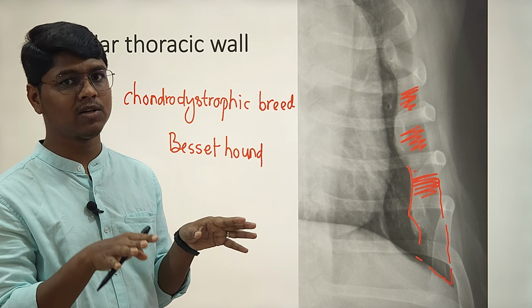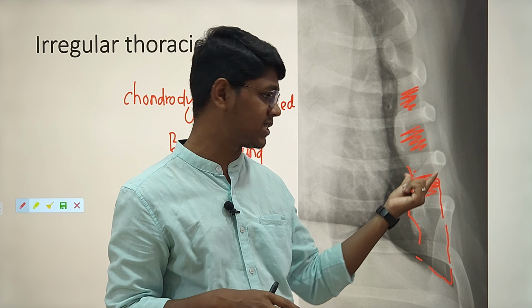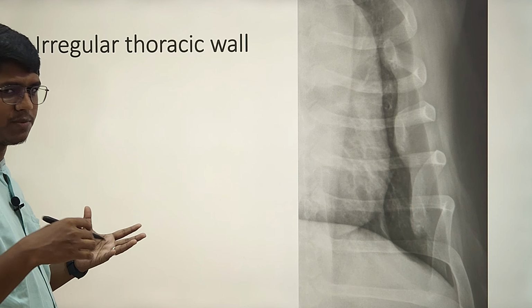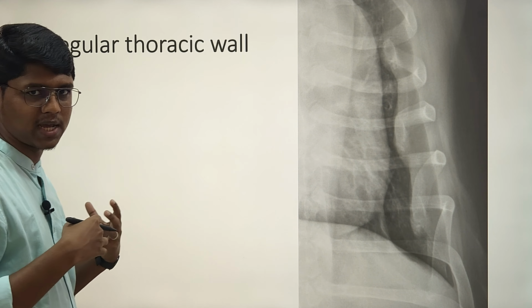While taking the radiograph of those animals, be careful regarding diagnosis of pleural effusion based on only this. You have to check for other symptoms and signs. This is basically to keep you checked. Just because you found this one does not mean you have to diagnose it.